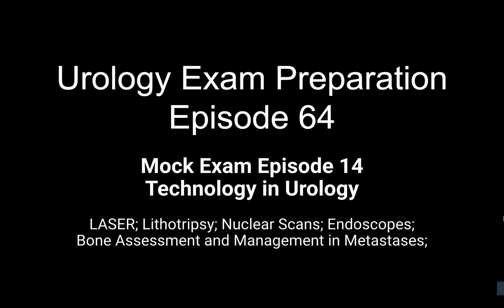Okay, say for example, in a patient you need to evaluate ureteric drainage. You are performing MAG3. How will you prepare the patient? So I would explain to the patient that this is done in a nuclear imaging department, and it will involve the insertion of a cannula with injection of radionuclide agent, and then furosemide injection. I would tell the patient to come in well hydrated and to empty the bladder prior to the procedure and to remove any metallic object on the body. And then I will explain to the patient the procedure takes about 30 to 40 minutes to complete.